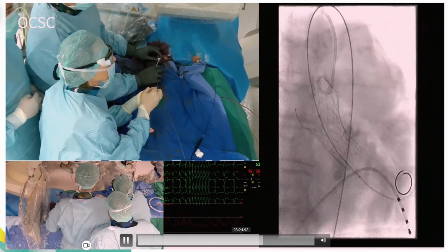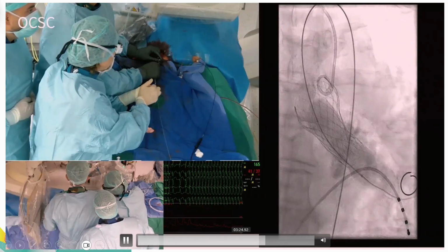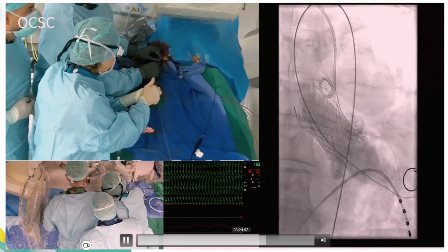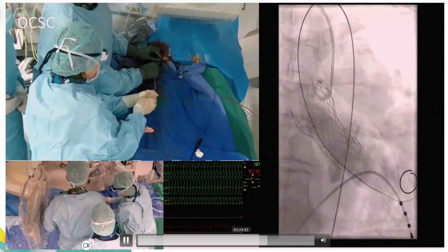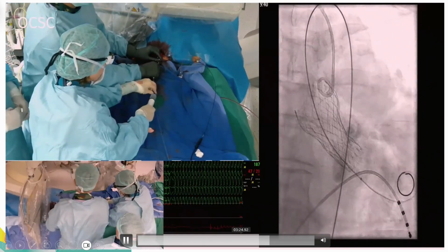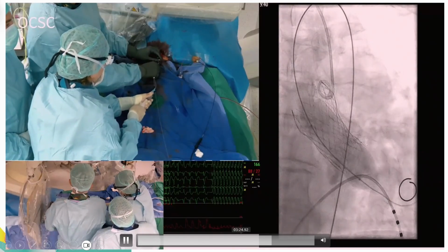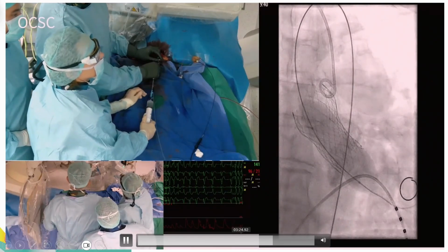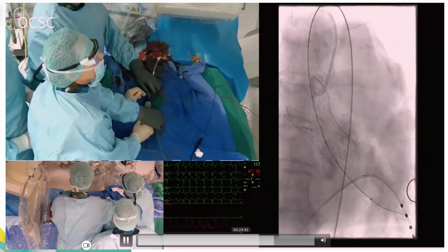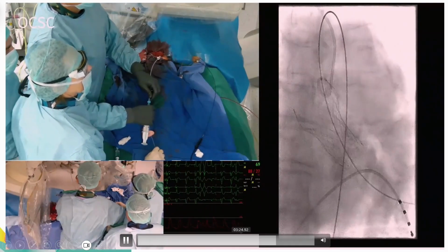We always use the screening CT to identify the proper sizing of the balloon, and then we had, of course, to deal with the post-dilatation. And you can see here how the opening is really, I would say, dramatic, and with some recoil at the end of the ballooning.